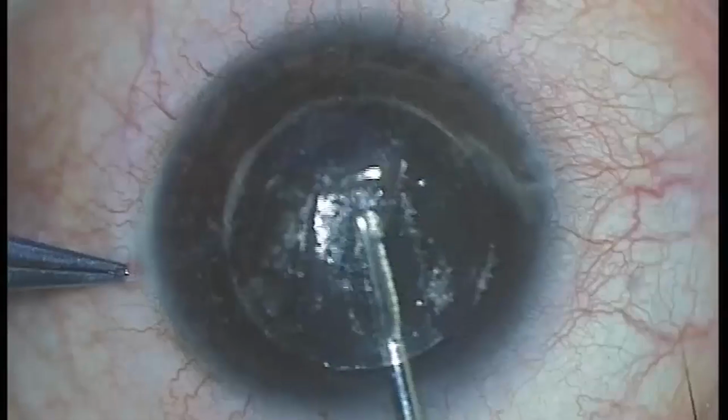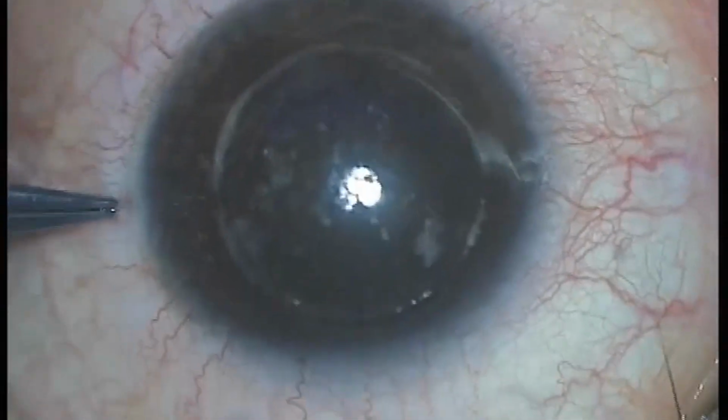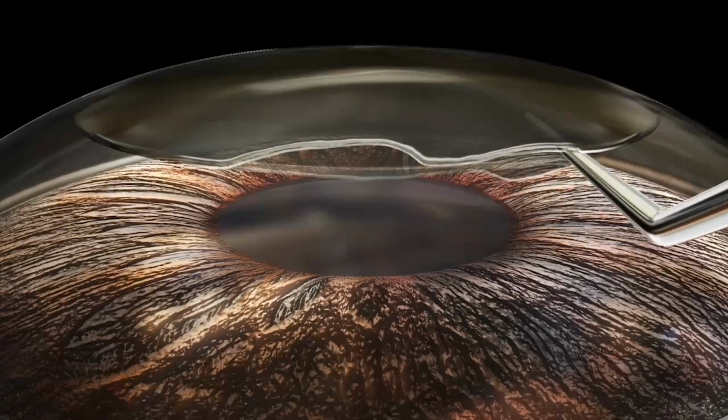The lenticule was brought out with a microforceps after completing the dissection. Graphical video shows absence of ridge sign confirming lenticular misdissection, that is unintentional initial posterior plane dissection.